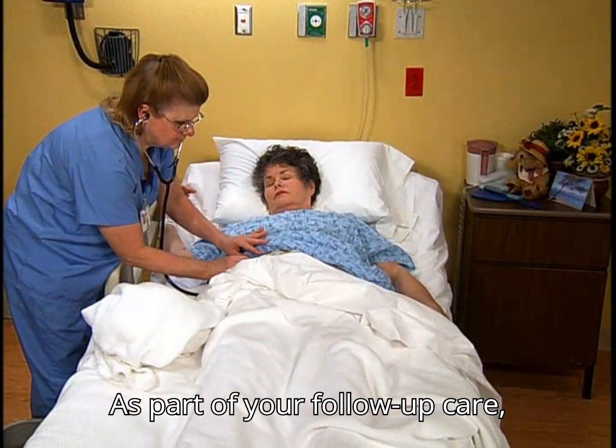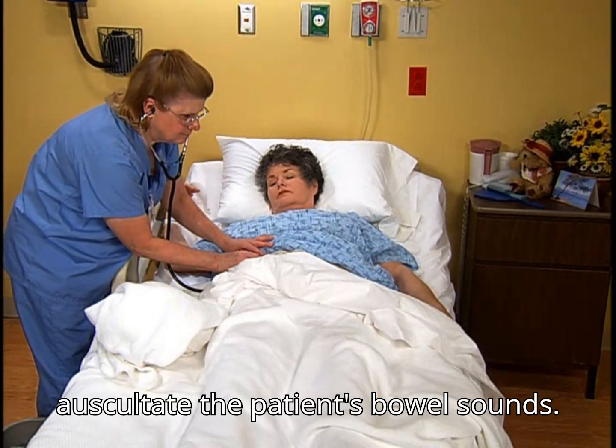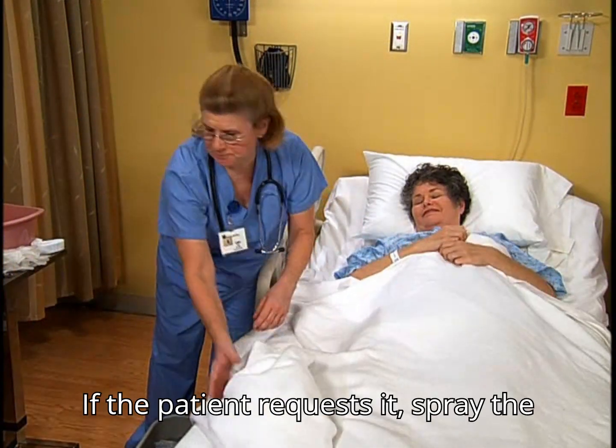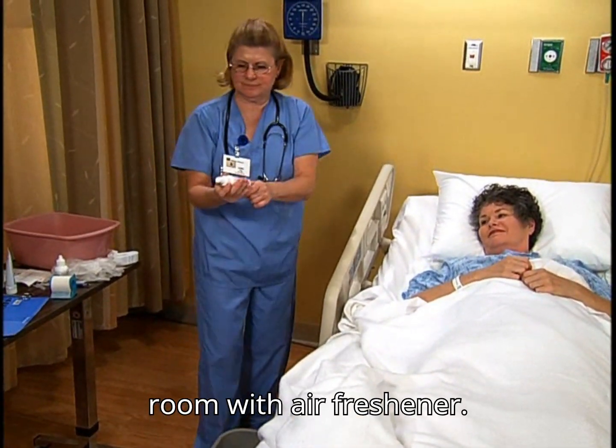As part of your follow-up care, auscultate the patient's bowel sounds. If the patient requests it, spray the room with air freshener.